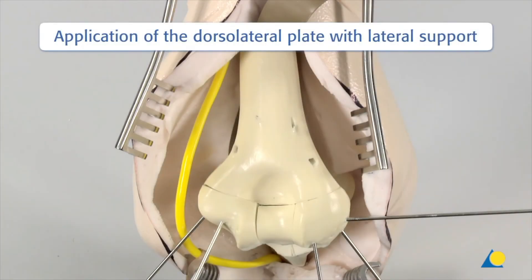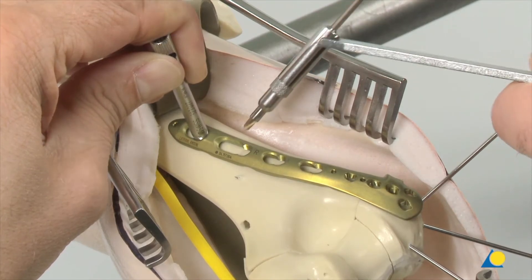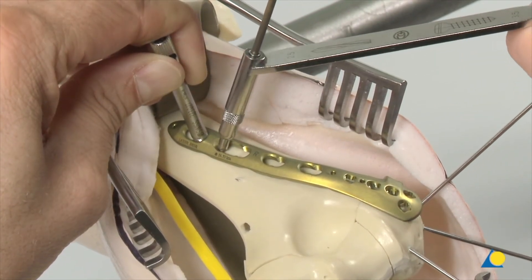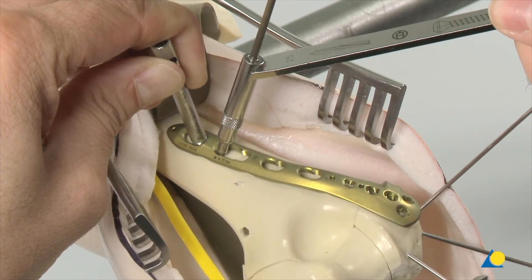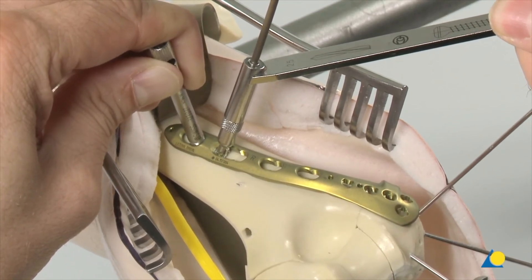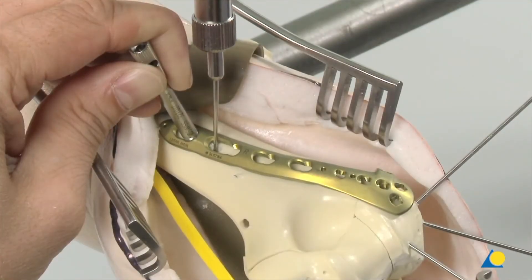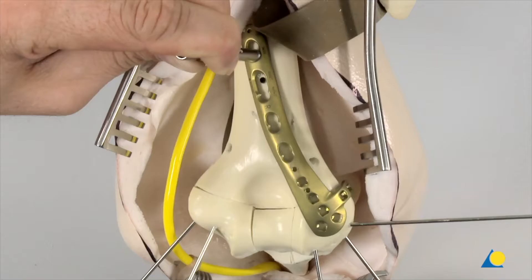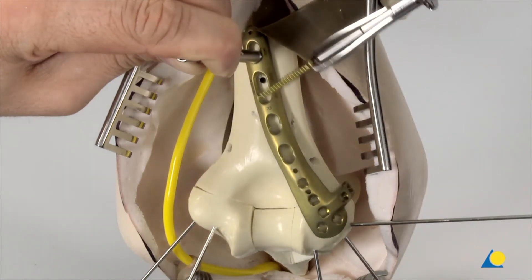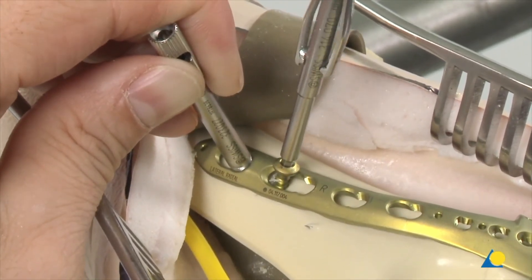Application of the dorsolateral plate with lateral support: position the dorsolateral plate on the distal humerus. Use the 2.5 mm drill bit with the 3.5 universal drill guide to pre-drill the bone through the DCU portion of the elongated plate hole through both cortices. To set the screws in a neutral position, press the drill guide down. Determine the required length of the cortex screw using the depth gauge. After tapping if needed, insert the appropriate 3.5 mm cortex screw using the hexagonal screwdriver. Do not fully tighten the screw.